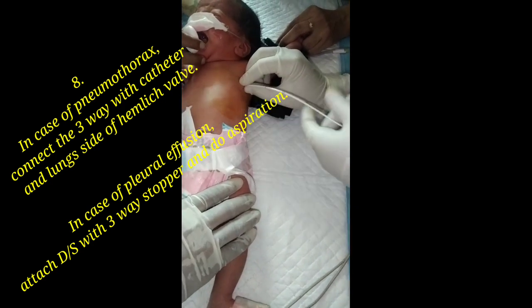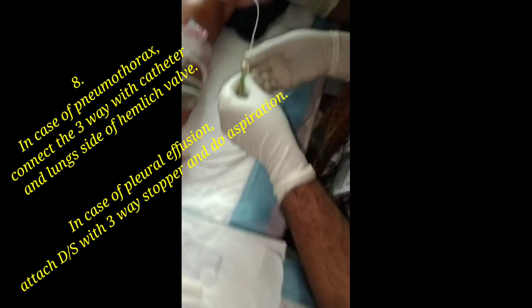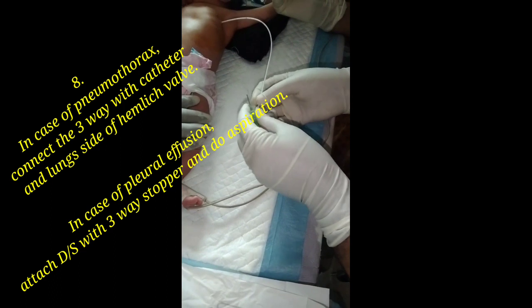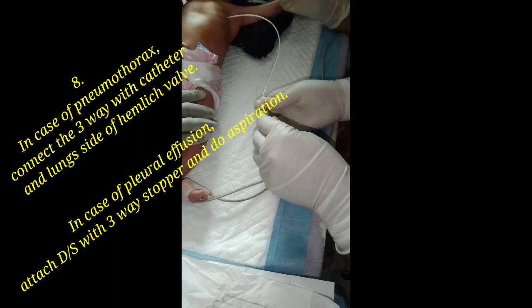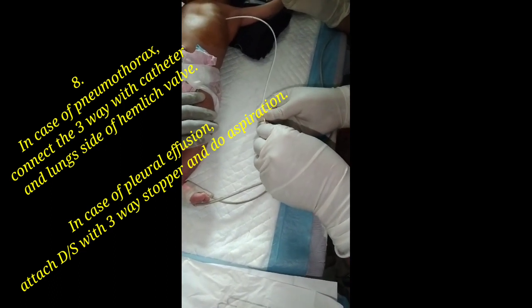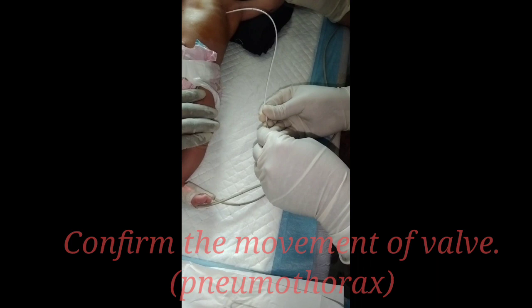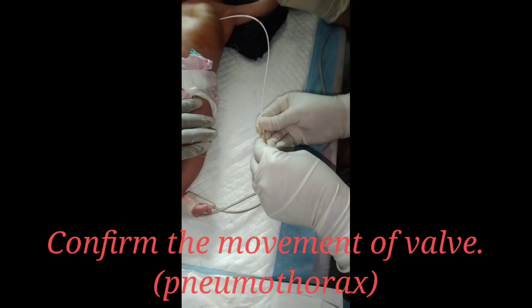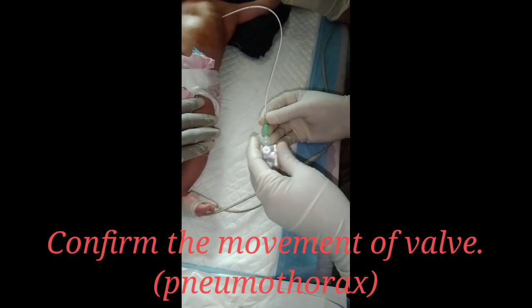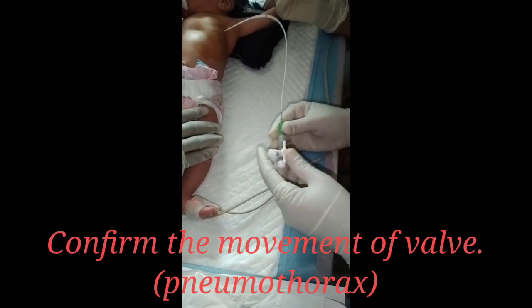Eighth: in case of pneumothorax, connect the three-way stopcock with the catheter and the lung side of the Heimlich valve. In case of pleural effusion, attach a distal syringe with a three-way stopper and aspirate. Confirm the movement of the valve in case of pneumothorax.